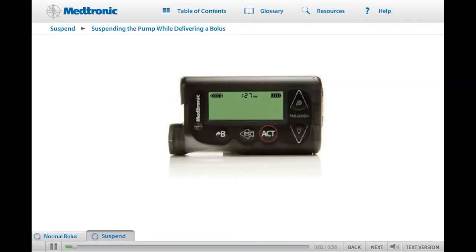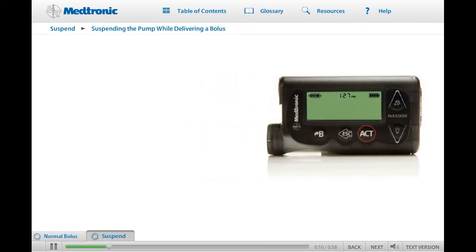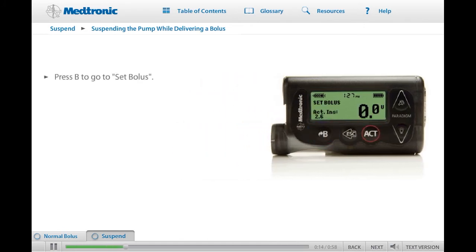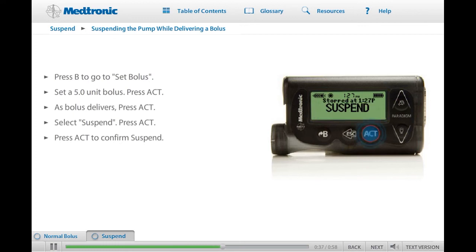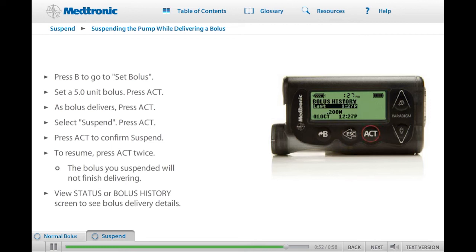Next, we will practice suspending a bolus delivery. To do so, first we will need to program a bolus. You should not be connected to your pump at this time. From the home screen, press the Express Bolus button to display the Set Bolus screen. Press Up to set a bolus of 5 units. Press Act to begin bolus delivery. When the bolus begins to deliver, press Act again. Suspend is highlighted on the main menu — press Act. Suspend will flash on the screen. Press Act again to place the pump in Suspend and stop the bolus delivery. To see the exact amount of insulin that was delivered before the bolus was suspended, resume delivery and then look at the status screen or go to Bolus History in the bolus menu. Remember, the bolus does not restart when the pump is resumed.